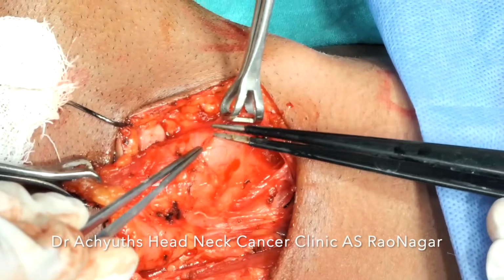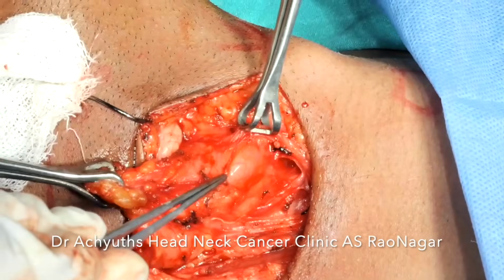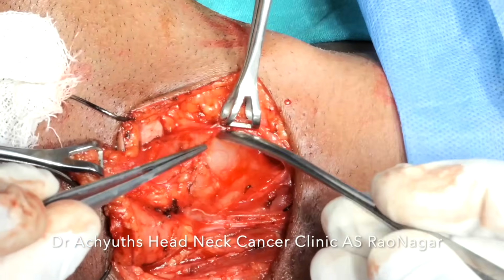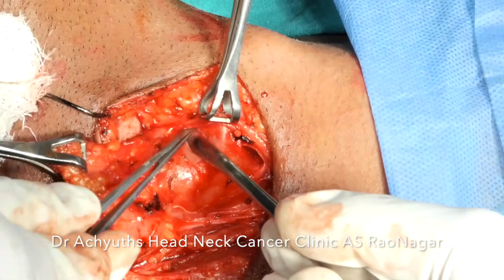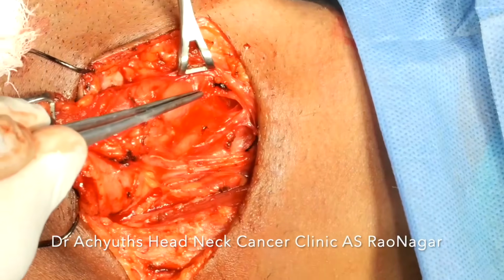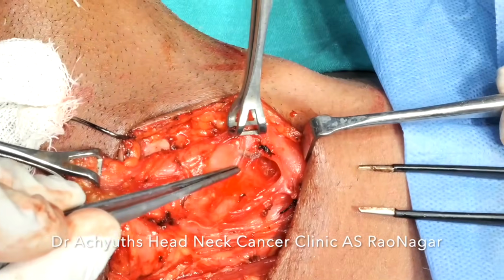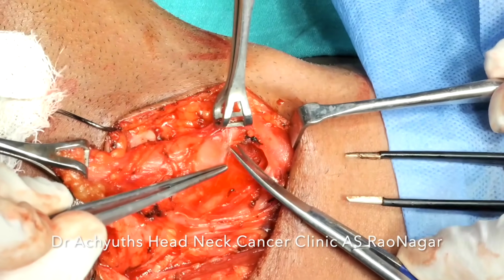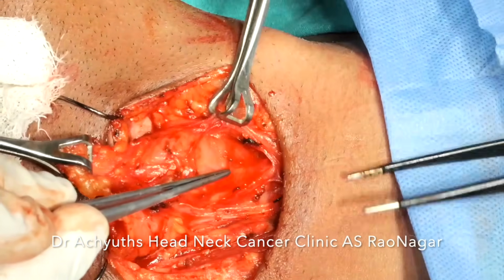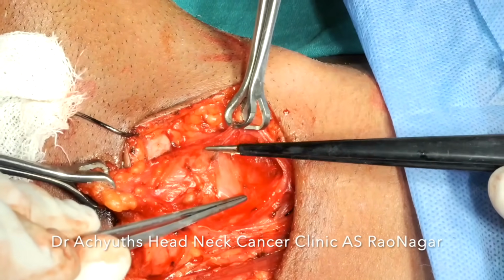I know I could have made a more concise and smaller video, but I just wanted to post almost an unedited video, so that these small nuances, like working around the fascial attachments with the cautery or with the help of a tonsil elevator, can be shown, because this is very important. Ultimately in this cyst excision, it is only that we are detaching it from the attachments, that's all. But how we do that is very important in this surgery.